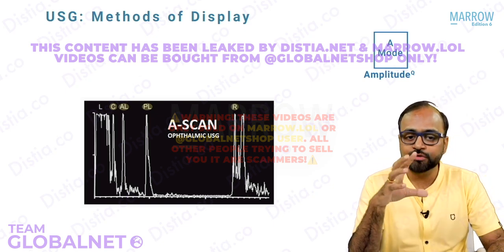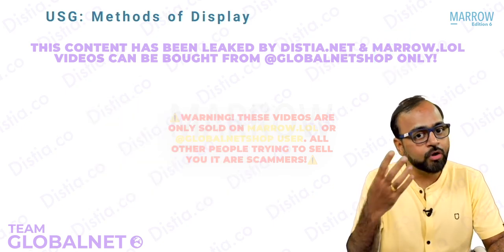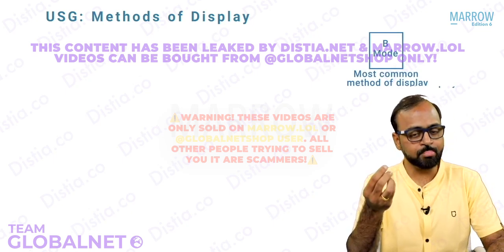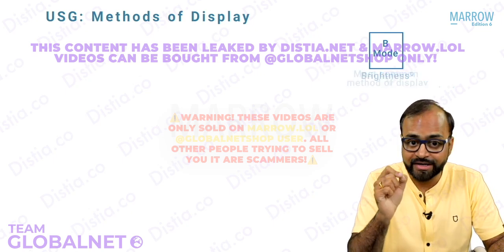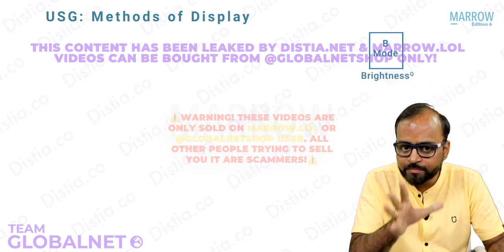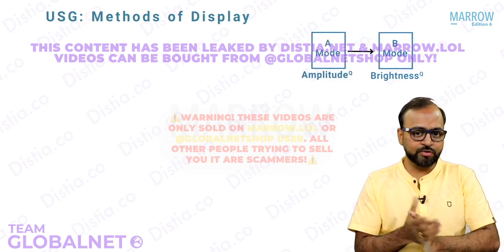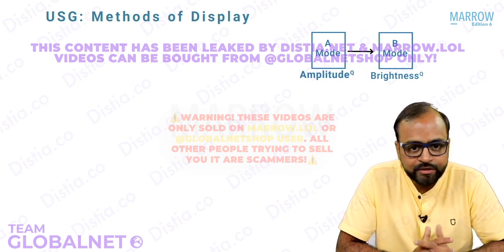But now we want to actually use ultrasound in the other body tissues. This is done by using the most common method of display, which is called B mode. What is B mode? B in B mode stands for brightness, remember. Now this B mode is actually just an extension of A mode. How is it an extension of A mode? See, in A mode, what do we measure? Amplitude, isn't it?